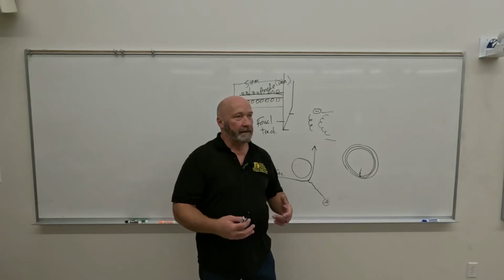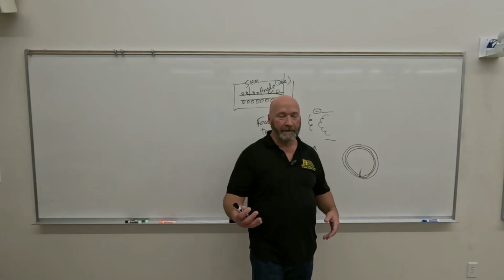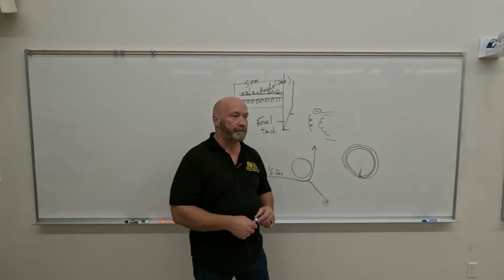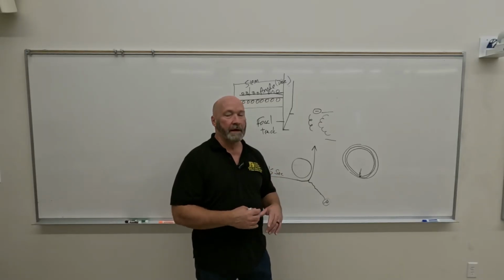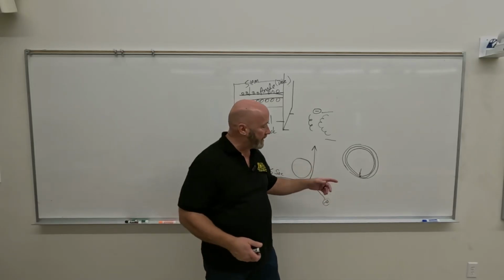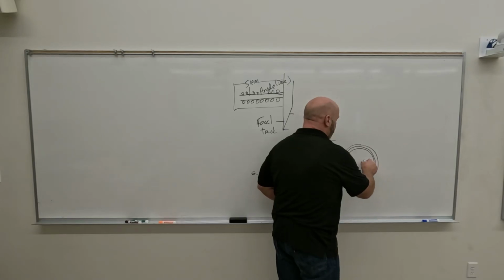Bushong says graphite. Graphite's probably going to be a backing, for a reason I'll talk about in a minute. But molybdenum is a common alloy that they'll use, or a disc face that they'll use. The purpose of the molybdenum is to allow the heat to spread out, not just around the focal track, but around the entire face of the anode.